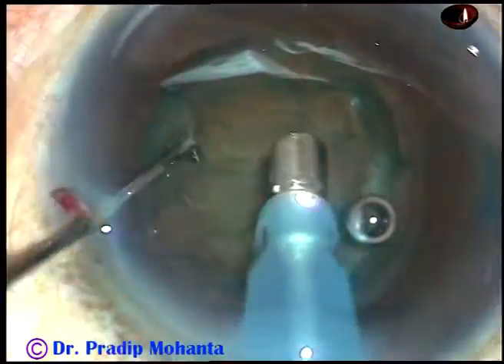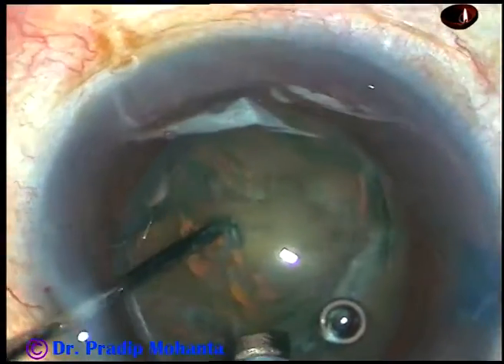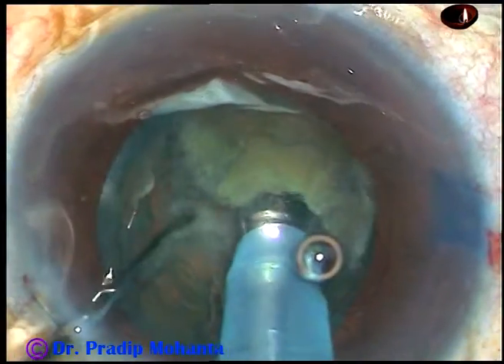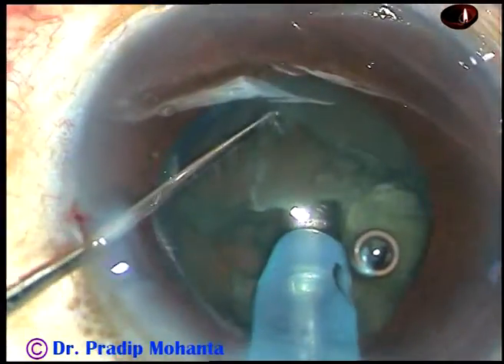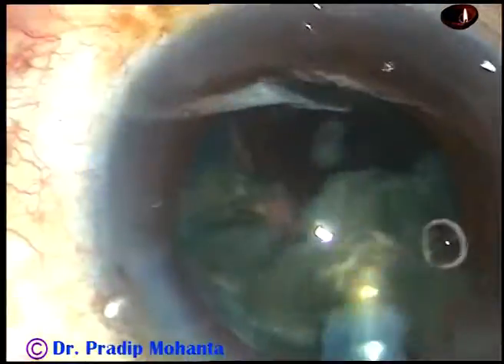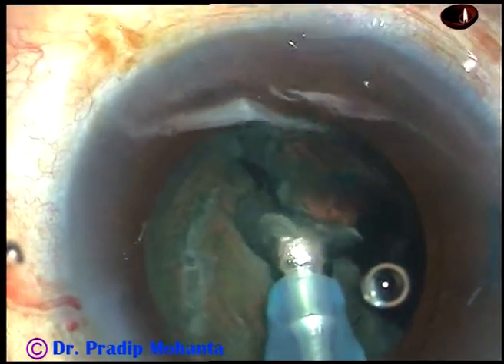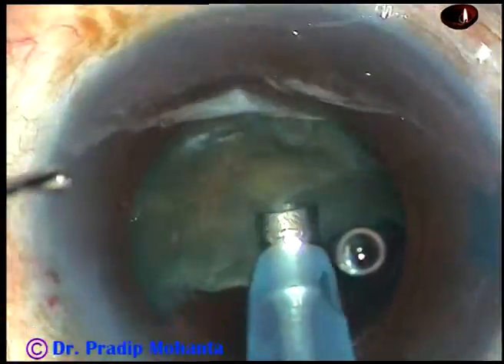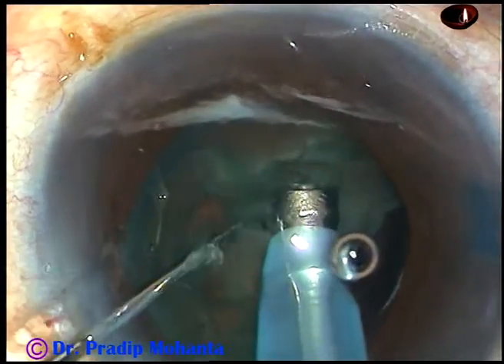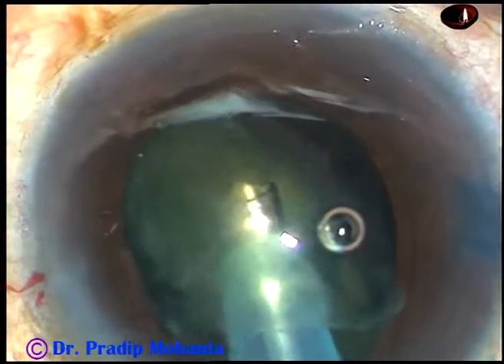Just remove some superficial cortical matter. Turn the tip. Make the phaco tip off. Now hold the nucleus right at the center — don't go beyond the center. Here it is, and chop it. Hold just at the center and chop. If you cross the central area and reach the softer part, you will not be able to hold it and it will not get chopped. So in grade 2 nuclear sclerosis, only the central part can be held by the vacuum.